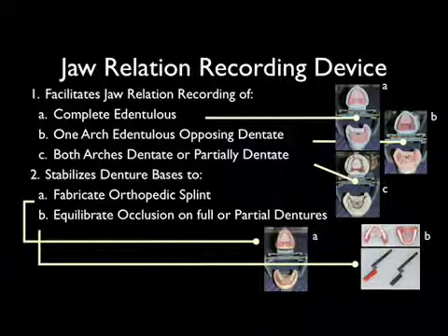This is the jaw relation recording device. It facilitates jaw relation recording of the completely edentulous, one arch edentulous opposing dentate, both arches dentate, or partially dentate. It stabilizes denture bases to fabricate orthopedic splints or equilibrate occlusion on full or partial dentures.